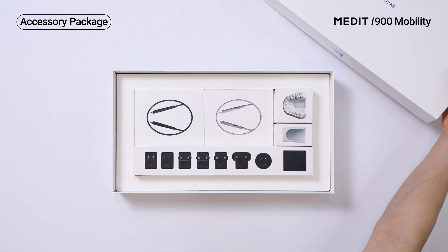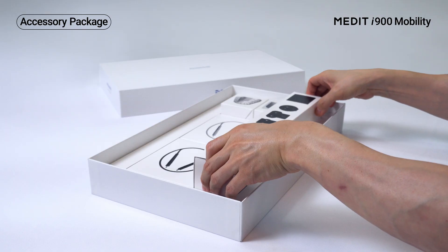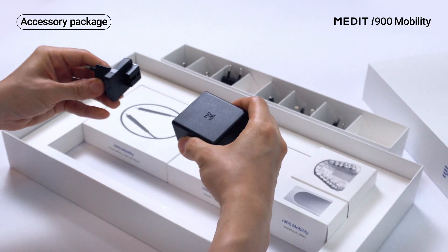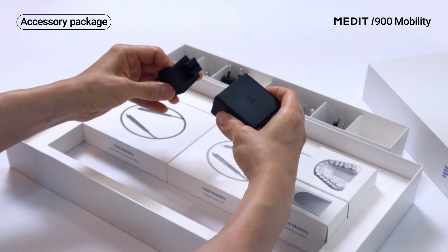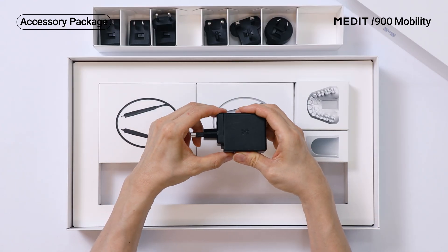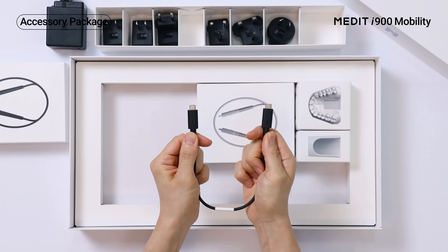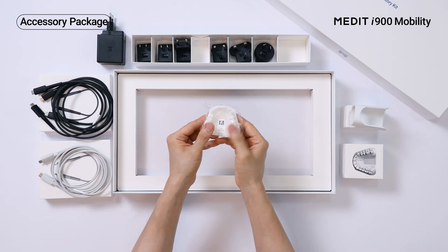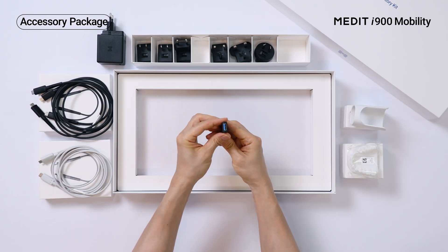Now let's check the accessory package. Here's a power adapter with seven connector types — it's compatible across multiple countries and environments. It also includes two power delivery cables and a charging cable, wall mount holder, practice model, and USB flash drive.